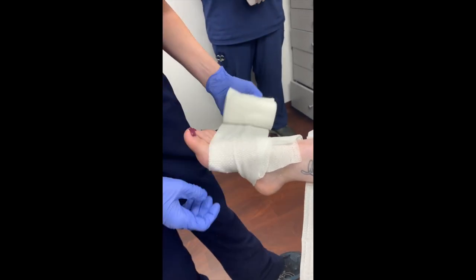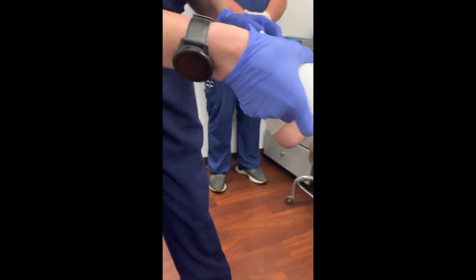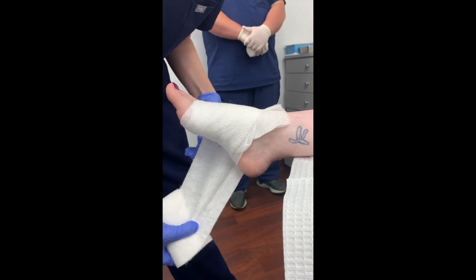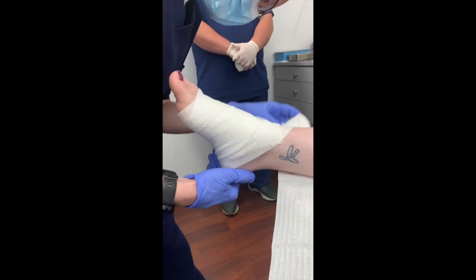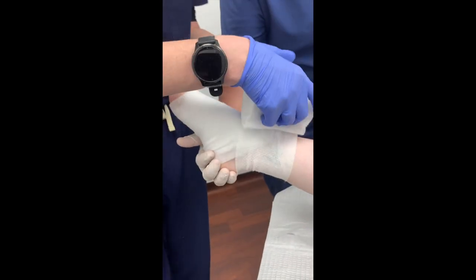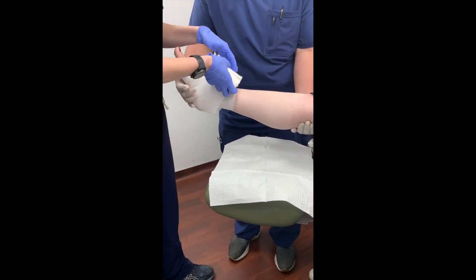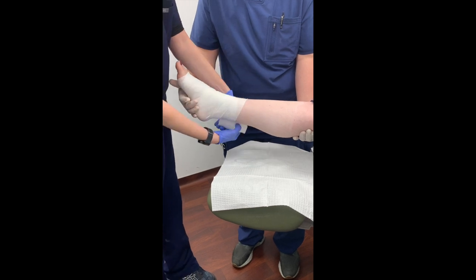Wrap your metatarsal heads — make sure to capture those. Try not to make any wrinkles because those can be uncomfortable for the patient even if they're non-weight-bearing in a cam boot. Come up and around. Some people struggle with the ankle joint getting the dressing to sit right. I recommend coming into the arch, right on the heel, and then following up and around that lateral ankle. You'll capture that heel on your next pass. Come down and around, have your assistant hold right underneath the knee, then come right underneath and fully capture that heel.